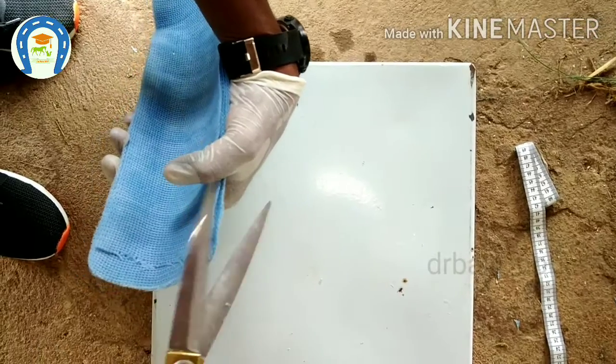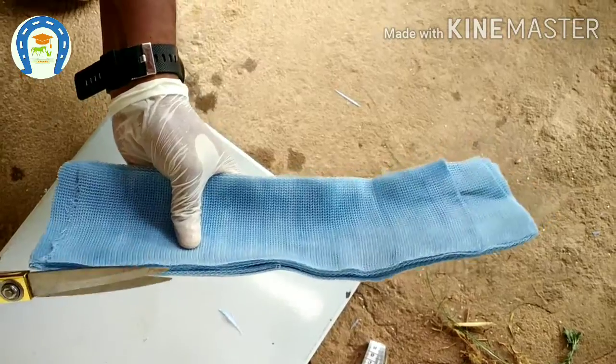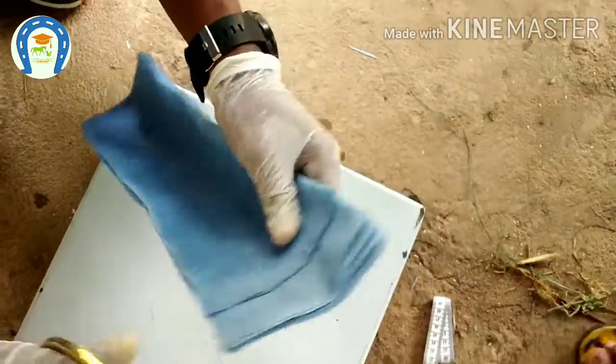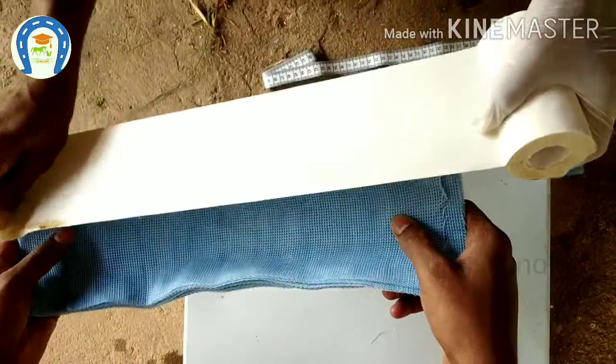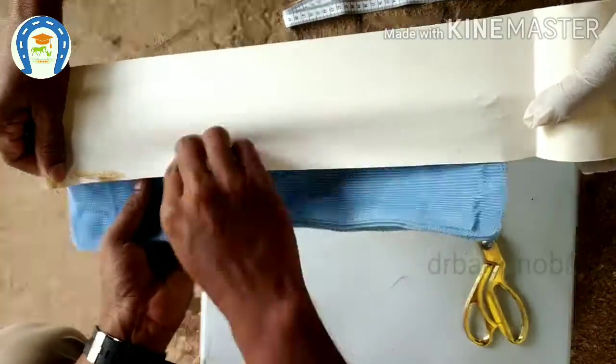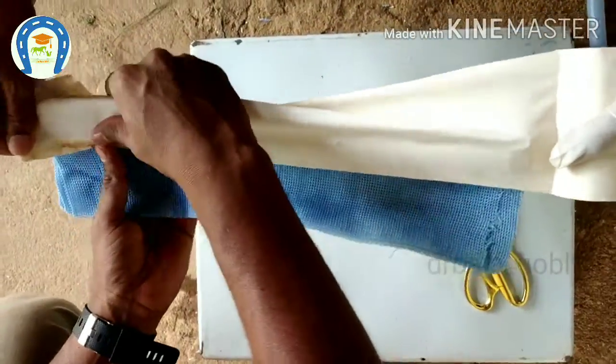I am cutting the sharp edges around the splint because sharp edges are very dangerous. Allow the splint to dry and get hardened. I am applying adhesive plaster on the edges so we can avoid injuries caused by the sharp edges.